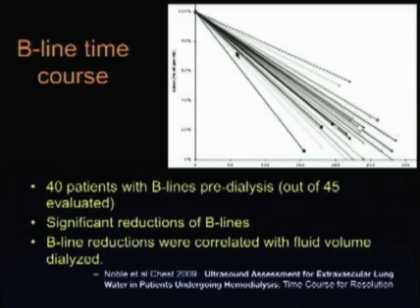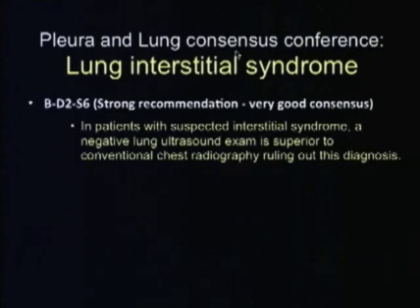And this actually brings up an important potential application of B-lines in monitoring therapy in patients who come in with increased extravascular lung water for any reason. It appears that B-lines develop quite quickly and go away quite quickly in patients who receive treatment.